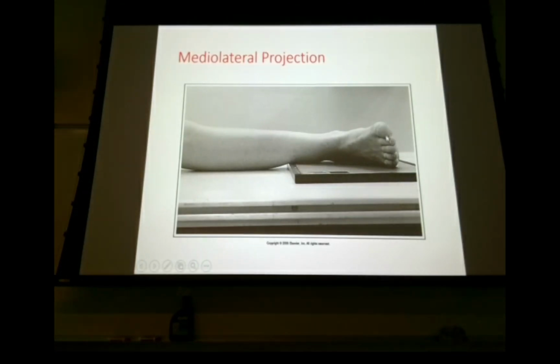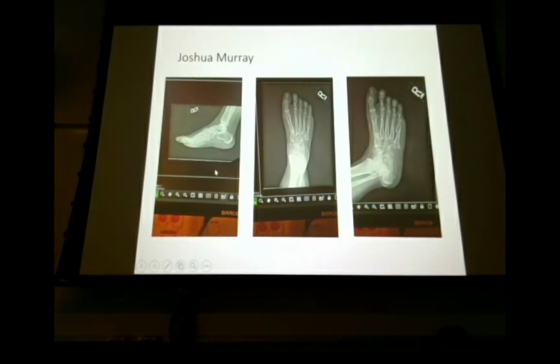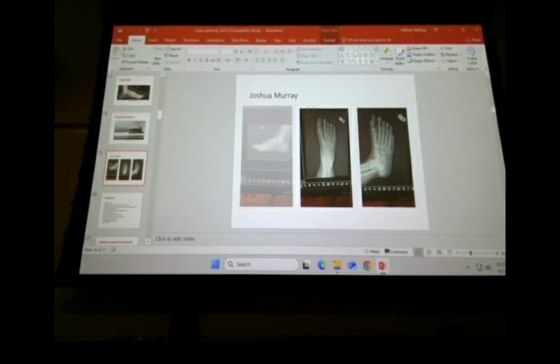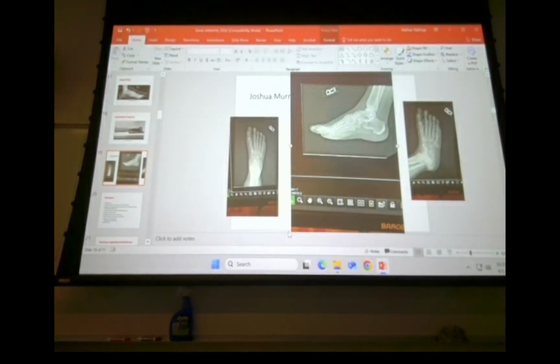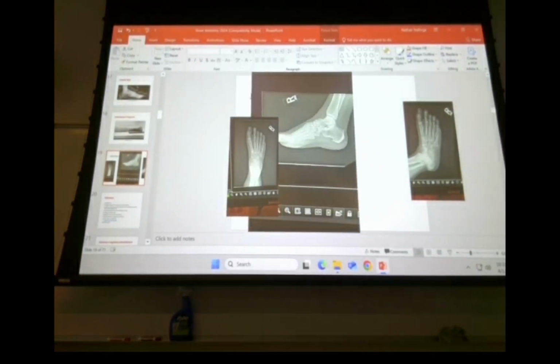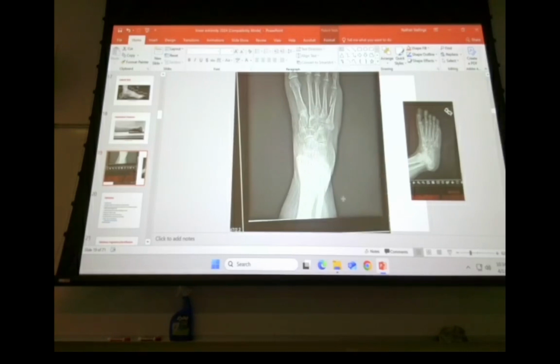Even on this one, if you notice, we're starting to get a little bit of supination in the toes, even though they're at 90 degrees. So this one Josh sent, let me magnify each one of these. Sometimes it doesn't want to cooperate all that well. So, ignoring the AP and the oblique, looking at the lateral, aside from a pretty nasty moire artifact, do you see anything wrong with that foot? I don't mean positioning or collimation, I just mean do you see anything wrong with the foot itself? The answer is no, you don't. But if I magnify this one up, now do you see anything?